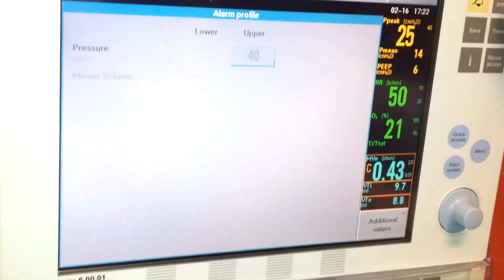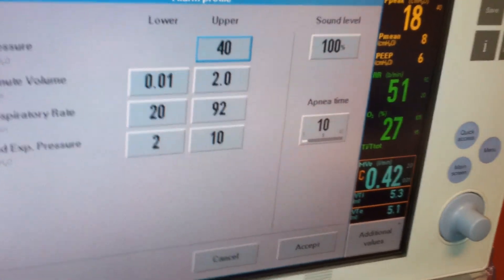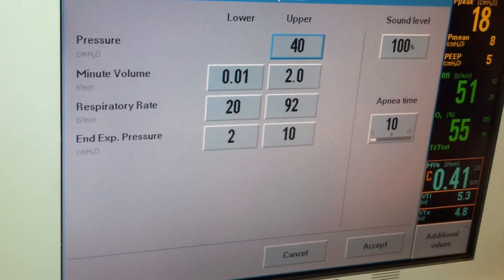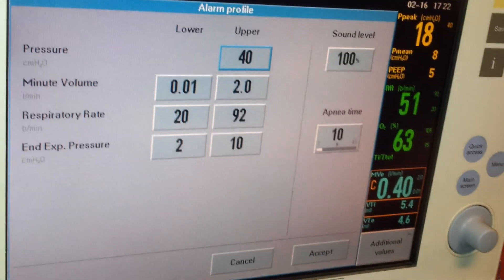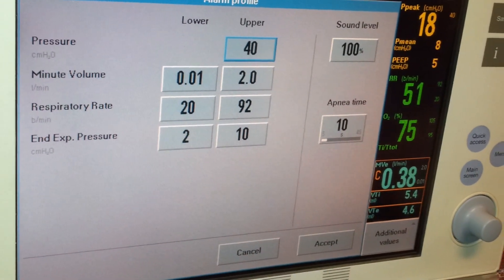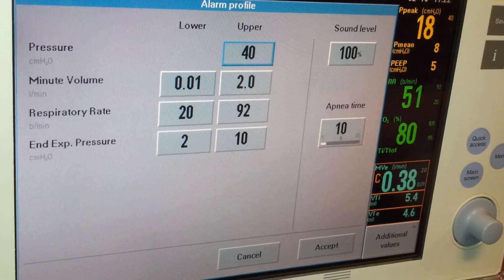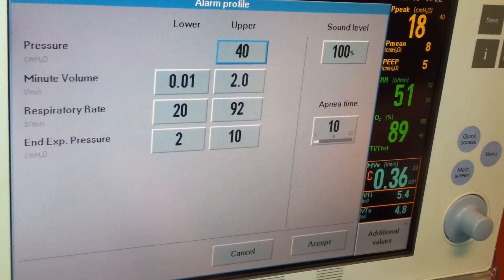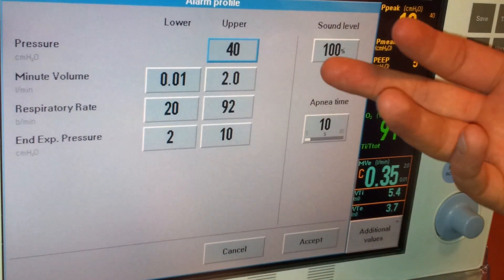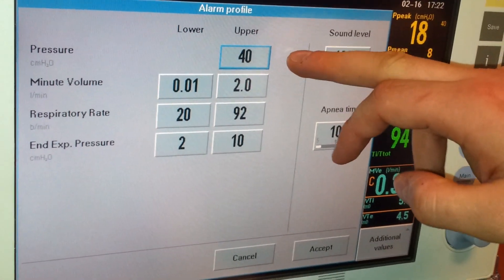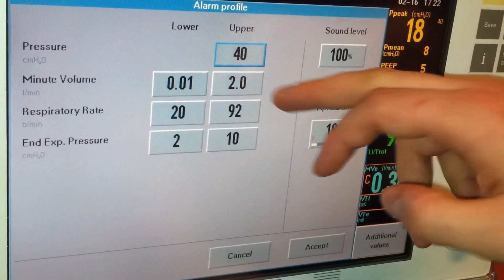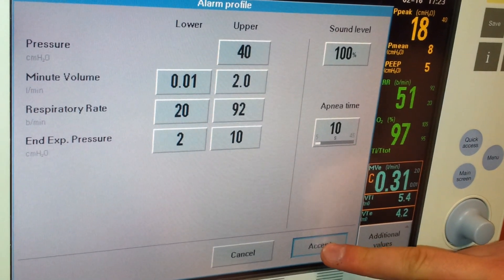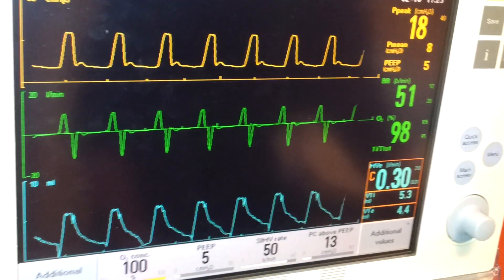Initially, you're going to keep the alarms very wide because when you hook the baby up, you're going to be making adjustments on the fly and you don't want any unnecessary alarms. You're always going to tighten them later before you leave. Right now it's set at 20 over 5, which is quite high — everything is set very wide, and we'll come back to that later when we tighten the alarms.